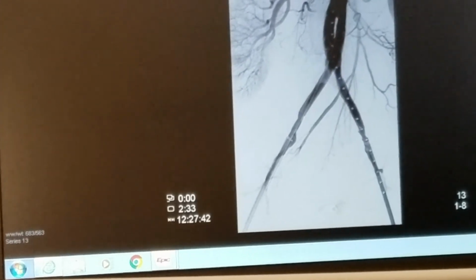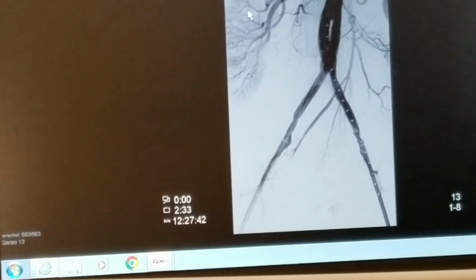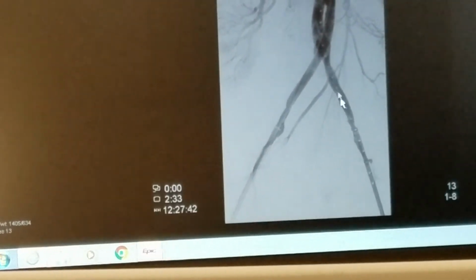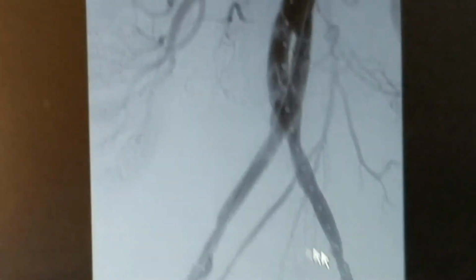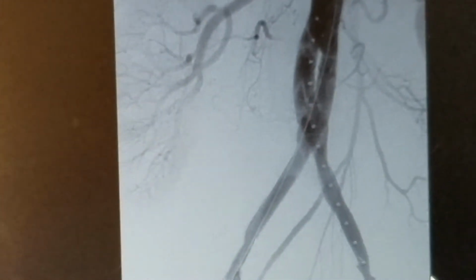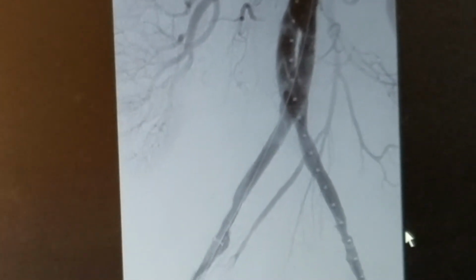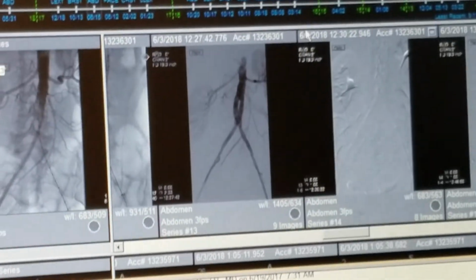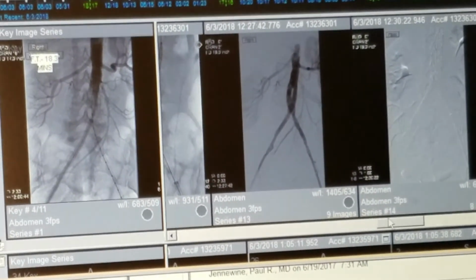Yeah, so this is the stent, actually. I see it. And you can even bring this down a little bit, and you can even see the wires inside the stent here. So the stent ends literally about here. Wow. And that's her. So that's what those dots are, okay. And almost looks like a person. Oh, did you want to take a picture? No, we were good. I'm videoing.